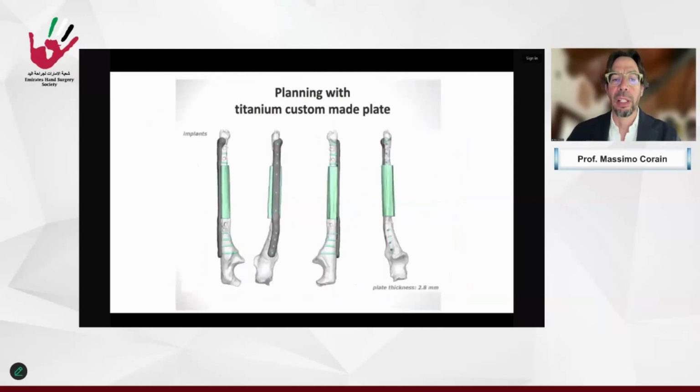So I asked them a custom-made plate with a strange shape, a large shape, in order to have 4 screws distally, avoiding the previous holes of the previous plate. So this is the simulation.